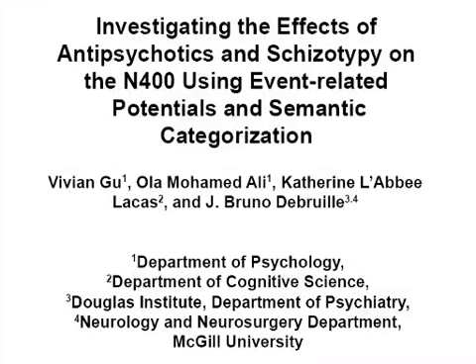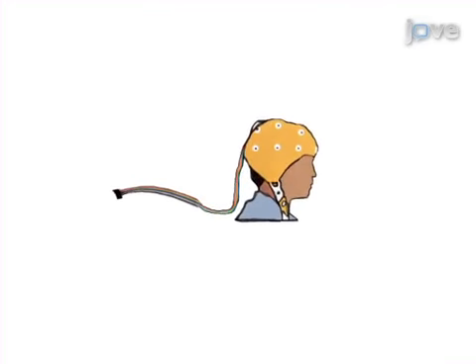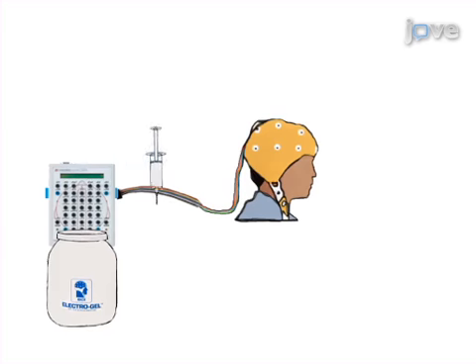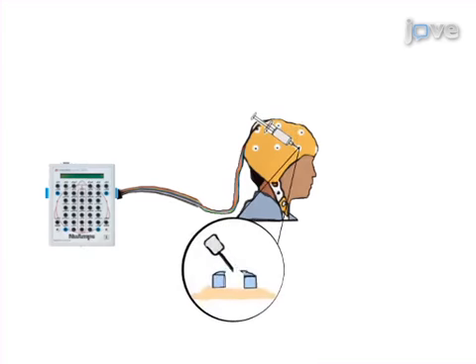The overall goal of this procedure is to illustrate the steps of proper data acquisition using event-related potential recording. This is accomplished by first placing an electrode cap on the participant. The second step is to insert electrogel into the electrodes of the cap using a syringe.